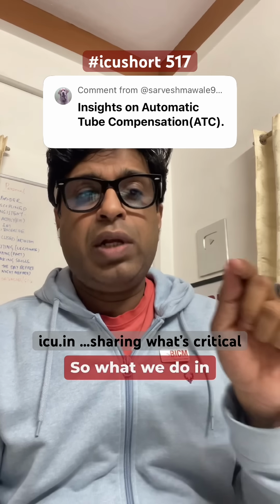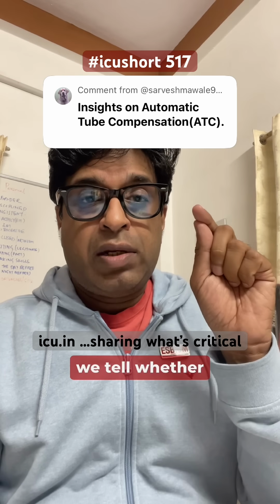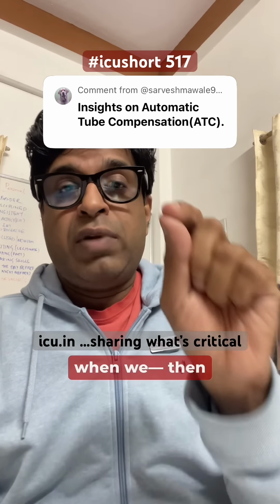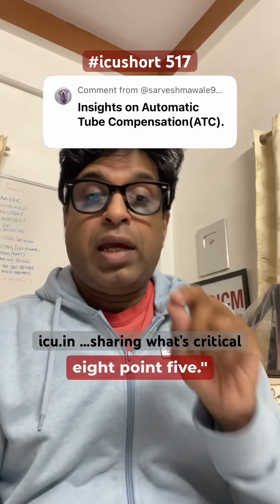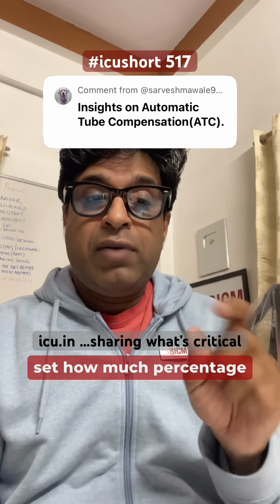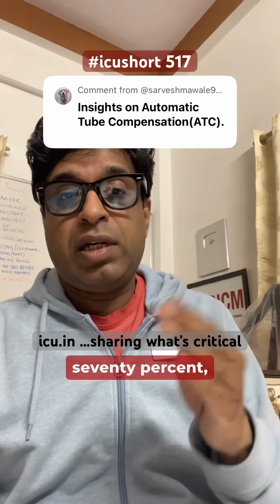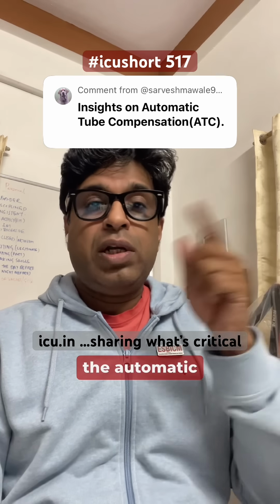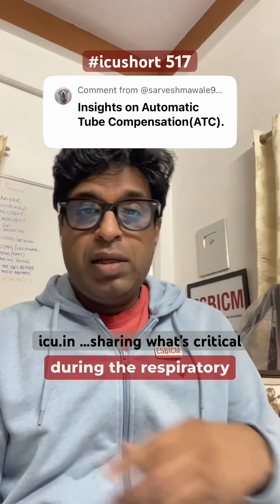So what we do in ATC, when we put on the ATC in that particular mode, we tell whether the patient has an endotracheal tube or a tracheostomy tube. Then we set the size of the tube, 7, 8, 8.5, and then we set how much percentage of compensation is required, whether 60%, 70%, 80% of the pressure that is required. Based on that, the automatic tube compensation adjusts the pressure support based on the tube during the respiratory cycle.